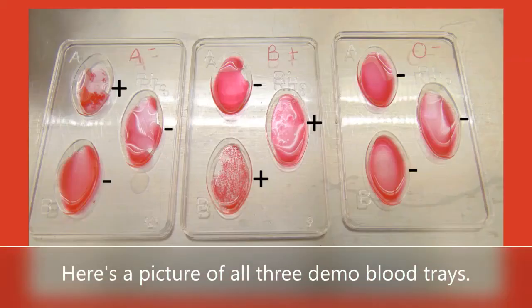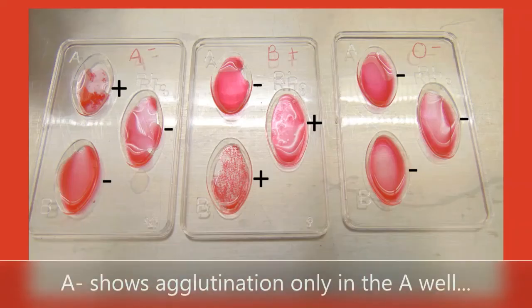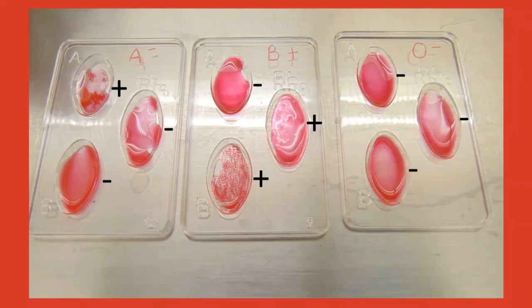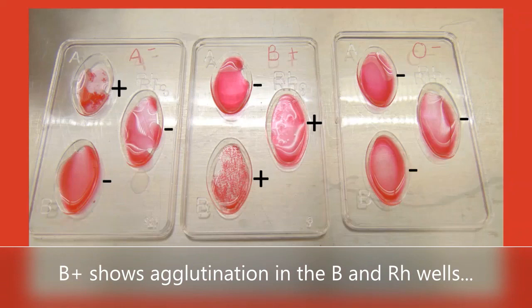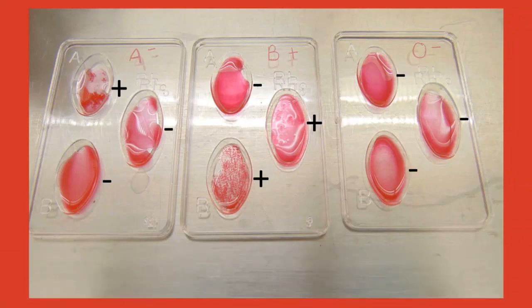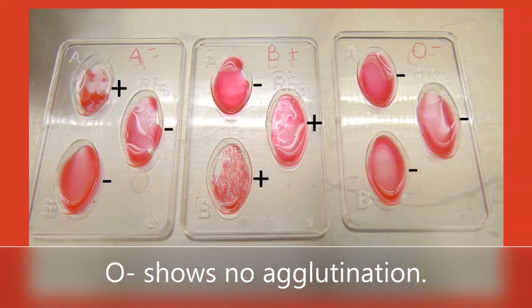Here's a picture of all three demo blood trays. A negative shows agglutination only in the A well. B positive shows agglutination in the B and RH wells. O negative shows no agglutination.